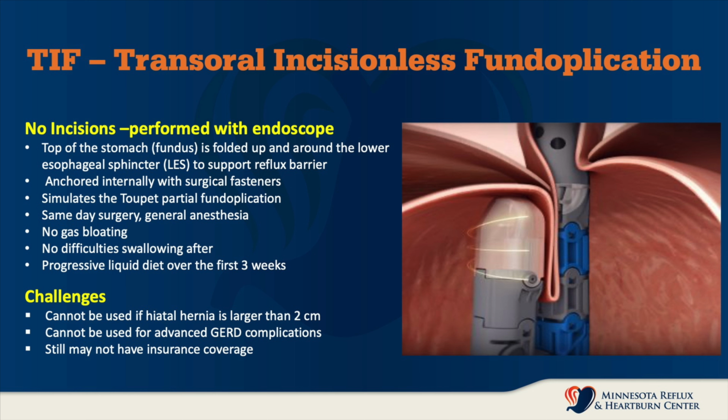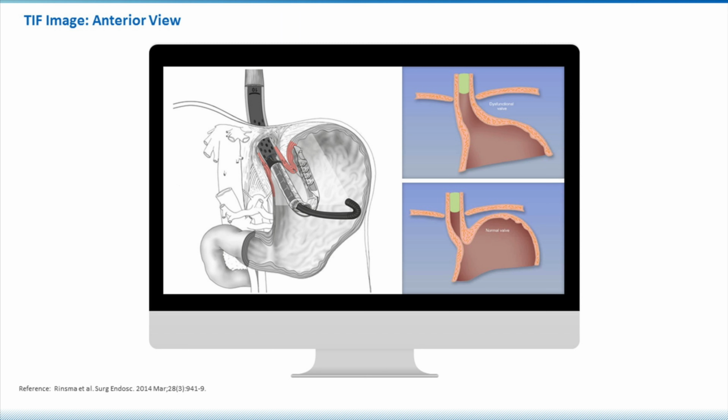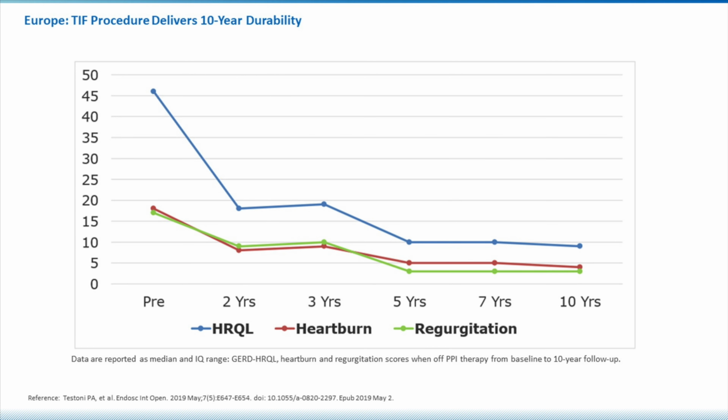If we look at the next slide, this is a pictorial where we can see the cutaway stomach. And we can see the device which has been inserted through the mouth and down into the stomach with the endoscope inserted through the middle of the device in order to monitor and perform the procedure. What we're trying to do here is take a person with GERD who has a fundus that is not up against the lower esophageal sphincter, and we're using this device in order to approximate the fundus to the lower esophageal sphincter. In these diagrams, we are able to see that the device, after pulling the fundus down in, fires these little H fasteners. We fire about 20 of them, and here's a picture of what it looks like afterwards. A beautiful nipple-like valve created that stops reflux.